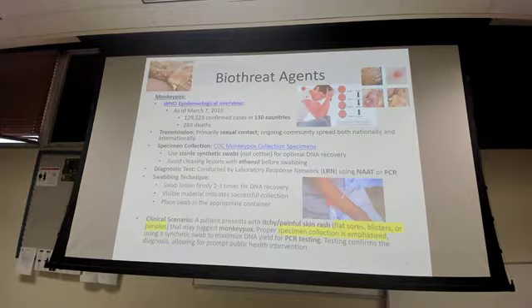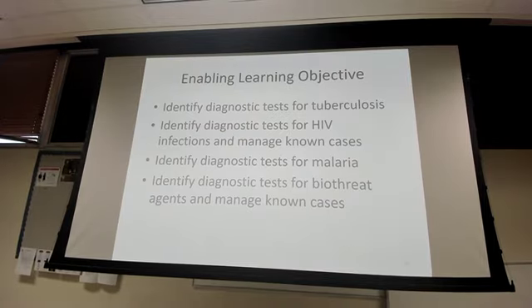But anyway, monkeypox. The CDC has their collection criteria. When swabbing the lesion, swab firmly 2 to 3 times for DNA recovery, and then place that in the appropriate container and let the lab know.